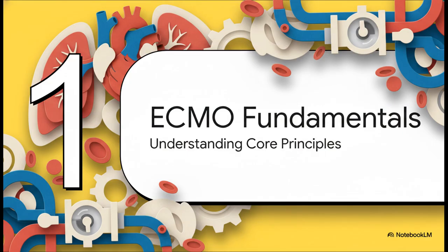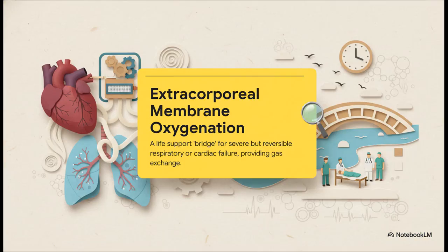Because truly, every single decision we make with these patients, whether it's the initial cannulation or managing a sudden crisis, is built on a rock-solid understanding of these core principles. So, at its very heart, what is ECMO? You can think of it as the most sophisticated heart-lung machine we have, but designed for the ICU. Now, the key concept I really want you to hold on to is that it's a bridge.